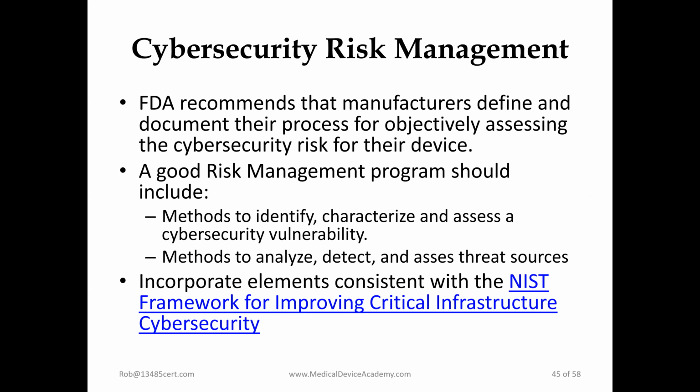So again, with cybersecurity risk management, they want you to define and document the process for identifying cybersecurity risks, and have methods to identify, characterize, and assess vulnerabilities. They want to see that you have implemented methods to analyze, detect, and assess those threats, and incorporate elements consistent with the NIST framework for improving cybersecurity. So again, this is something that you would have done during the development process and on the pre-market side of things, but they want to see that you have a plan for continuing to exercise these activities post-market. Next slide.